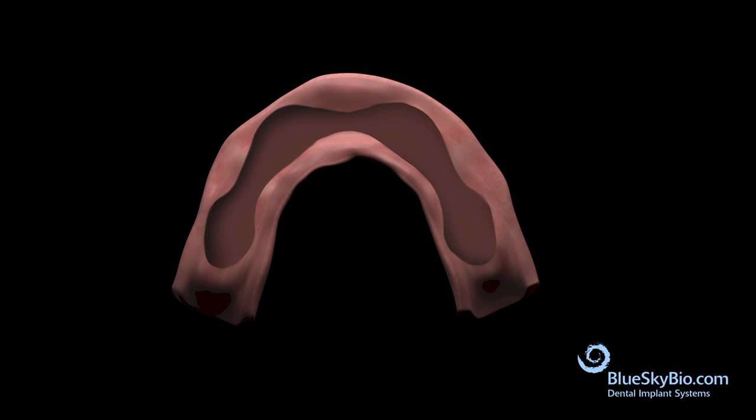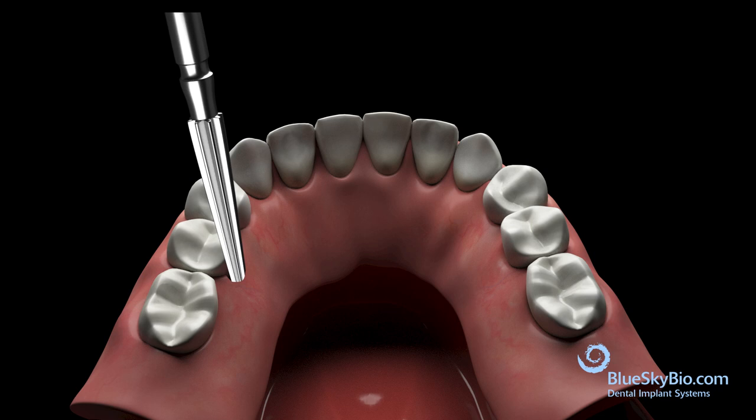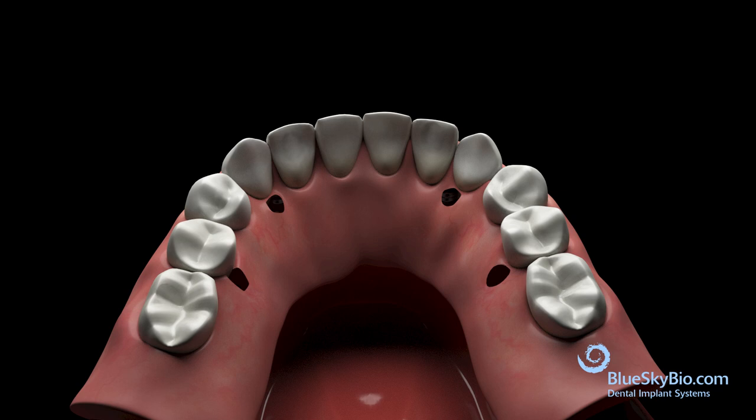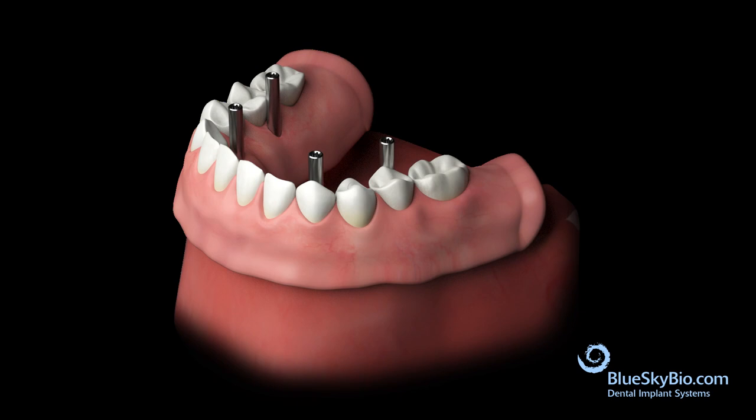Hollow out the internal of the denture so it fits passively over the Trilor bar in preparation for the pickup. Create small holes in the top of the denture for long multi-unit cylinder screws to protrude through. Syringe pink acrylic material into the denture, then place it back onto the bar and complete the pickup.